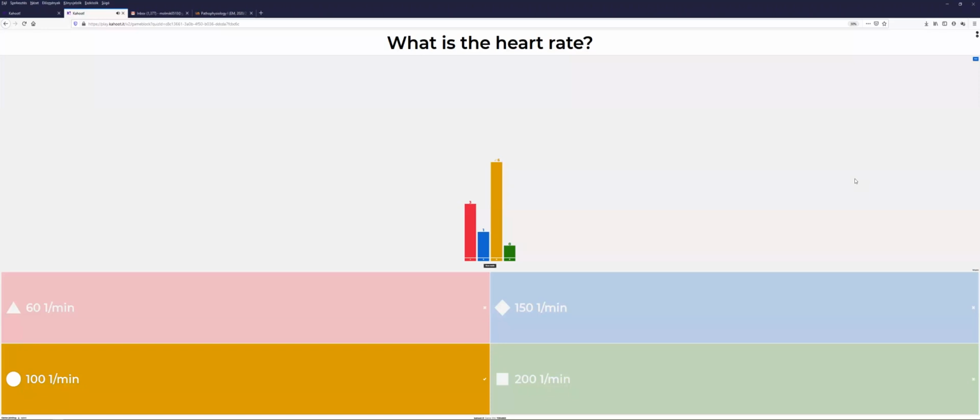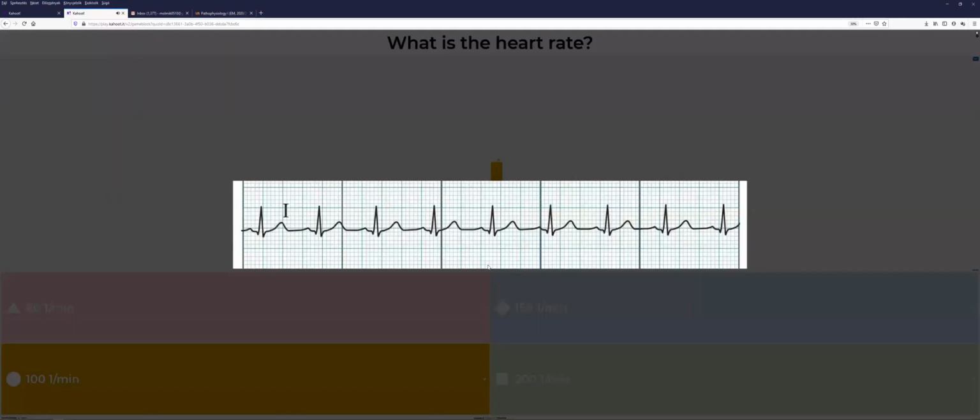All right, yes. So that meaning around 100. Okay, who can tell me how we can calculate the heart rate? Anybody?